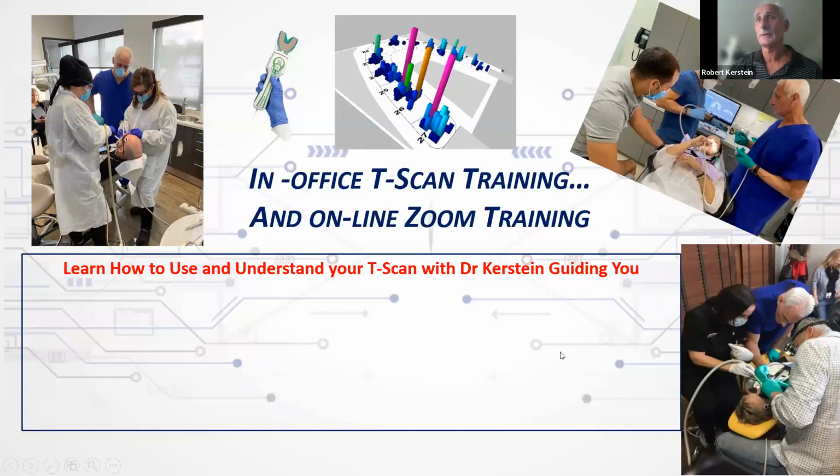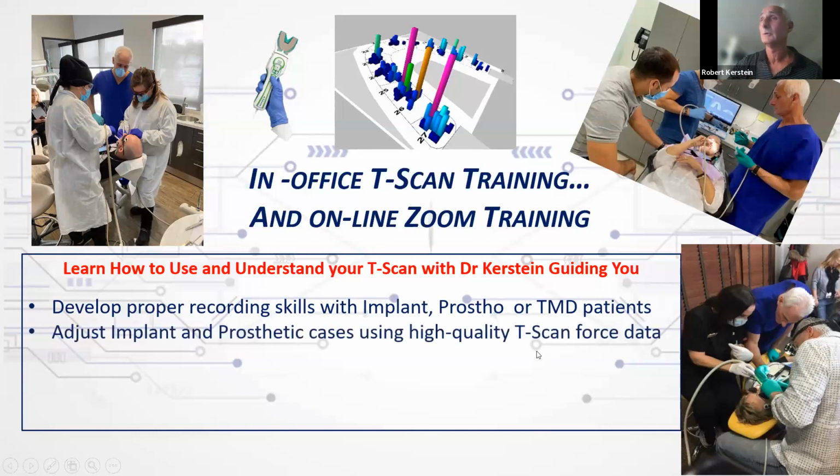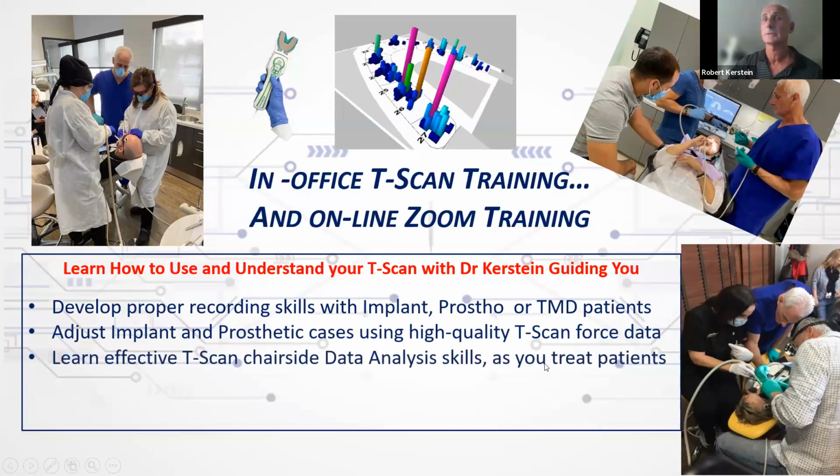The other way to learn, and this is by far the best way to learn, is to have in-office training or online Zoom training where I guide you through all of it. You can be taught on Zoom with a staff member how to record properly and how to analyze your data. But if you really want to learn how to use your T-scan effectively, chairside training with implant patients and prosthodontic patients or TMD patients, you're going to really learn how to use the T-scan, not only to diagnose, but to treat and to control your outcomes with metrics. Learn data analysis, learn how to install a high quality outcome as you treat patients with guidance from me.